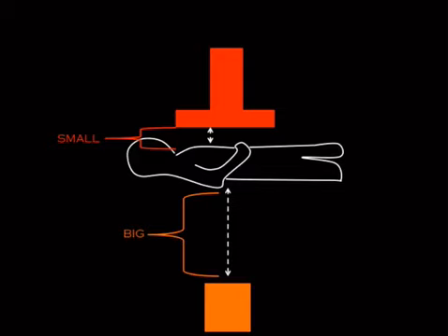Two, you've got decreased scatter to the operator. In other words, if you bring that thing down, with less X-ray scatter, you've got less radiation to you or less radiation to your eyes, etc. And the last thing is that it's actually going to increase the sharpness.